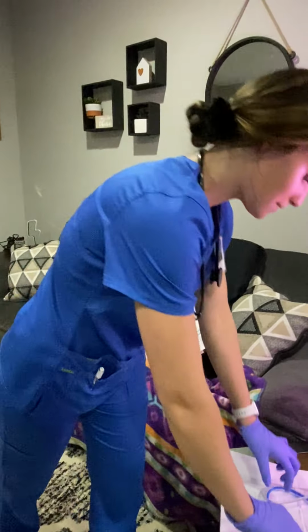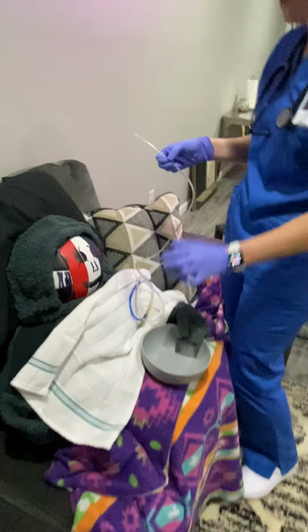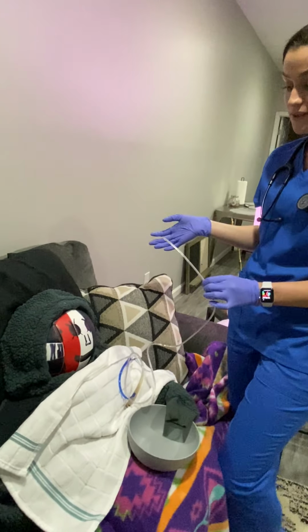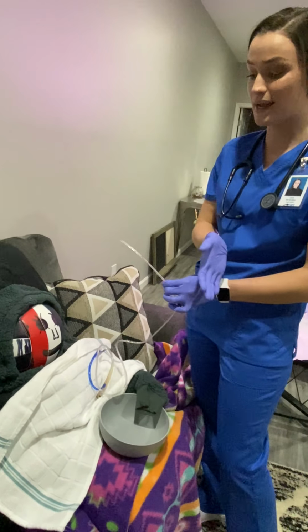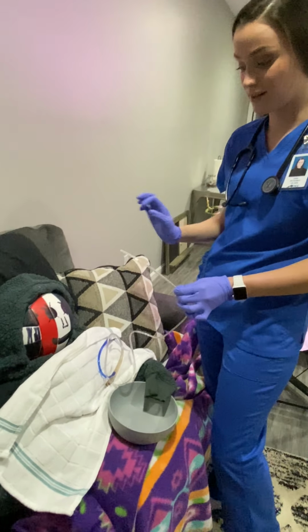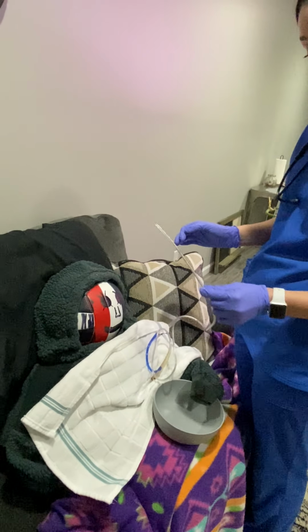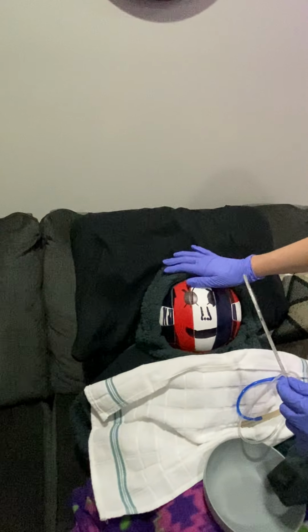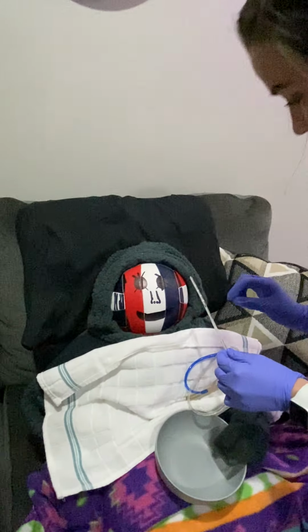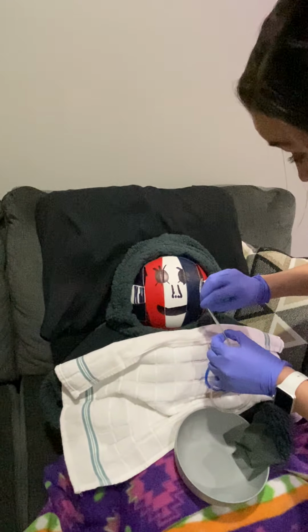All right, so I've got my NG tube. Now, during this procedure, I would have a second set of hands for the water so that whenever I tell the patient to drink the water, my helper can stick that cup in front of her and make sure that she's swallowing as I ask. So for the first part of inserting to my first line, I'm going to have the patient tilt her head a little bit backwards. And I'm going to insert, so here we go.